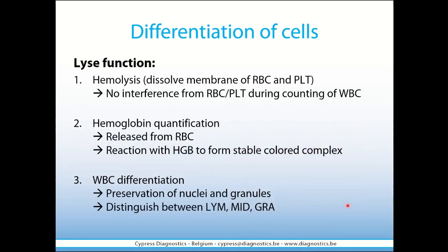So the lyse reagent has three functions. Hemolysis, which dissolves the membrane of red blood cells and platelets. This will ensure that there is no interference from red blood cells and platelets during the counting of the white blood cells.